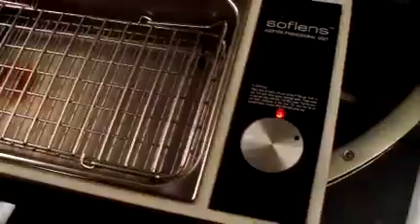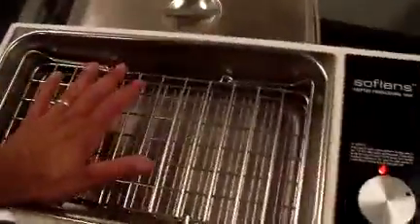It has its rack in it. It does power on. It does heat up.